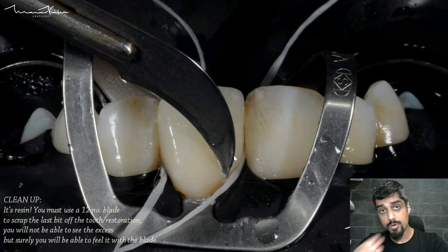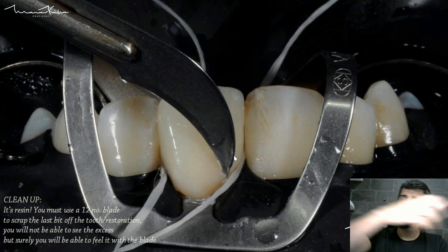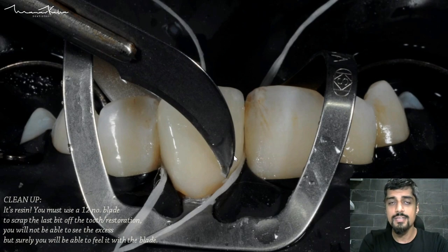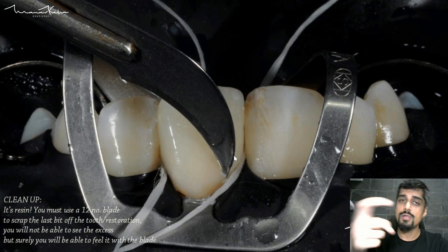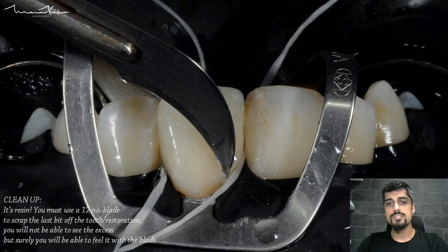Even after you have taken all precautions, you will and you should now take a number 12 blade and scrape — scrape all the excess resin cement that may have set and that you were not able to remove when it had not set. The other problem with resin cement is that it is such an aesthetic material that one cannot even see it once it sets — it just merges with the ceramic or the natural tooth. Use a number 12 BB blade and you scrape. You will be able to feel it, but you cannot see it. This is an extremely important step whether it's a veneer or a crown, anytime using resin cement.